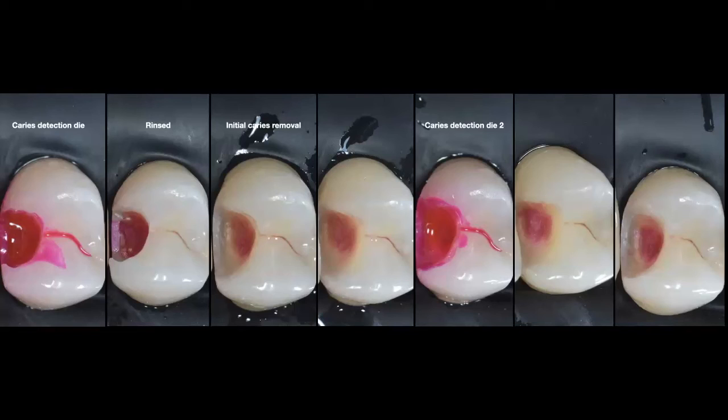When you think about it, you have all these substrates. You have the enamel, you have the clean DEJ, 2 millimeters within the DEJ. You have a little bit of pink and a little bit of a darker pink left on the axial wall. If you think about it, all these walls, all these different substrates, different levels of mineralization of these substrates are definitely going to give you what has been published in the literature as the hierarchy of bondability.